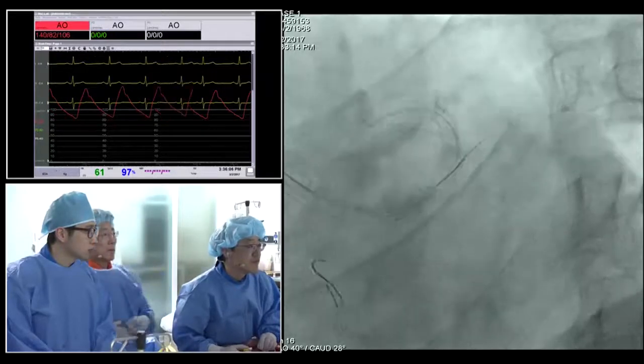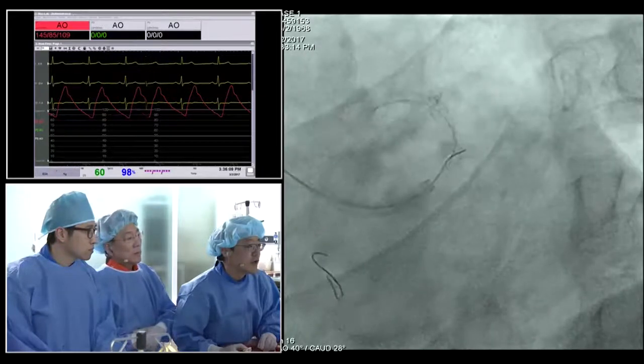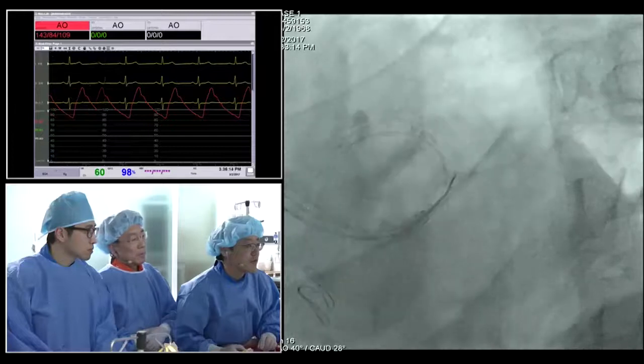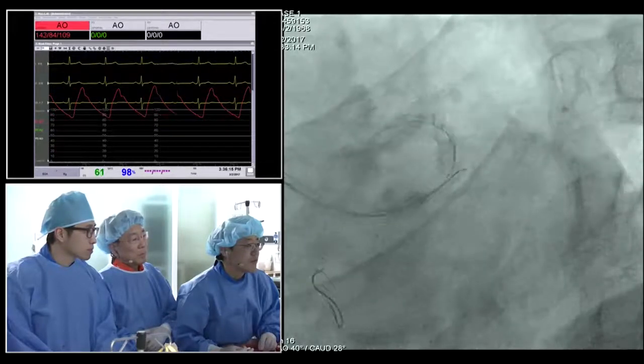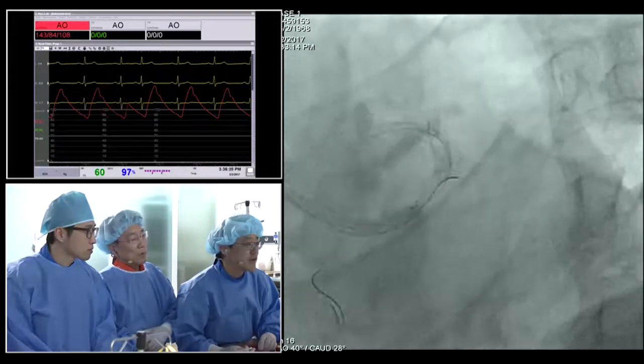We have 6 minutes? We have 5 minutes. That we'll manage. So before rewiring, I think proximal optimization is very important.